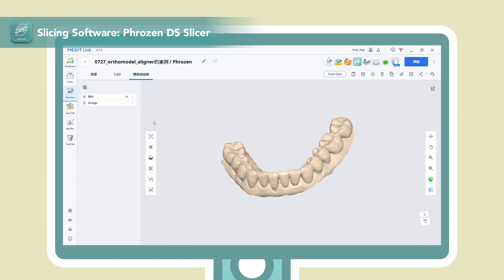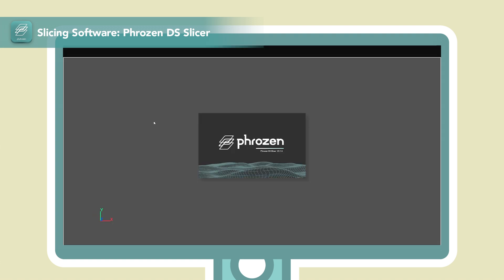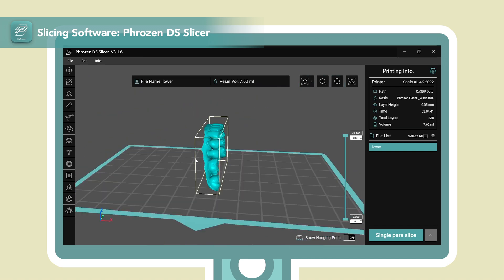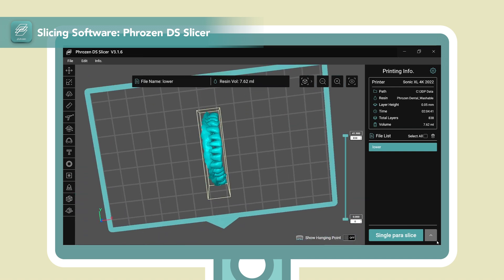Phrozen DS Slicer is an advanced slicing software for dental indications, where most of the pre-settings can be automated, making it much quicker and less guesswork.